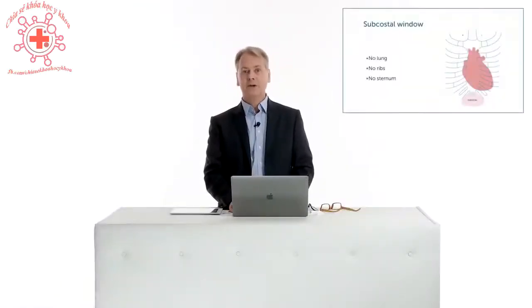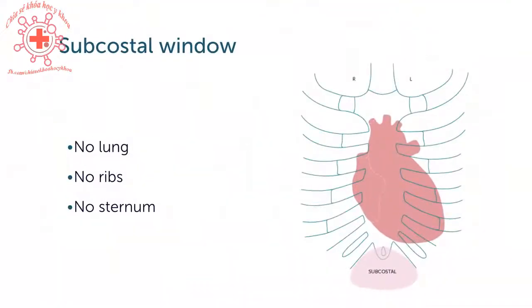The subcostal window. I sometimes call it the forgotten window because it's underutilized. Definitely, the subcostal window should be a part of every exam. Where is the subcostal window? Well, it's below the xiphoid, where you're imaging from the abdomen towards the heart.